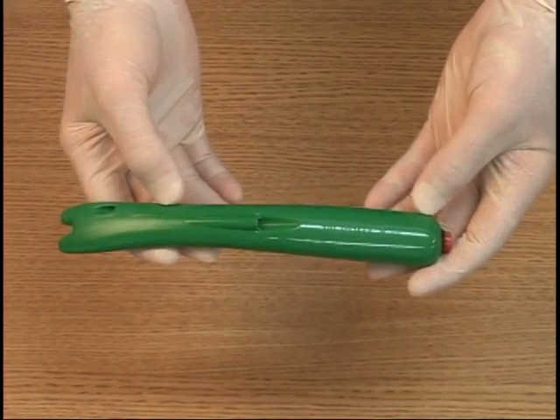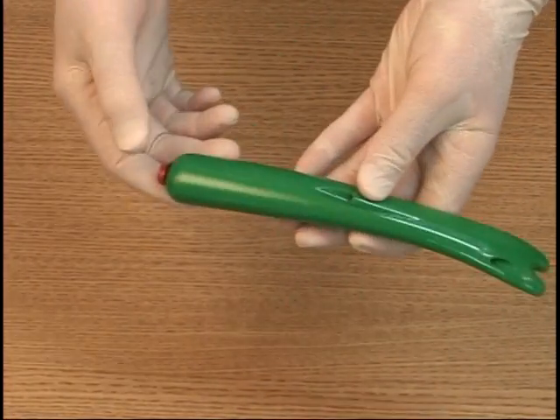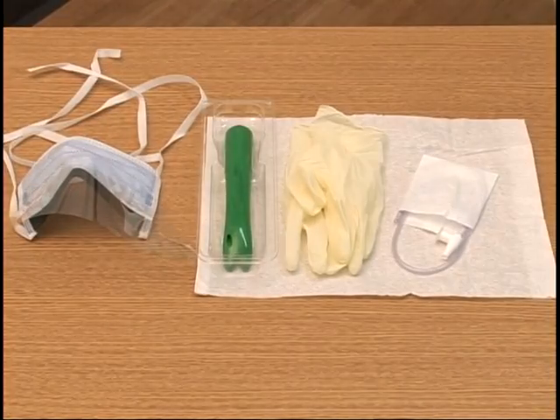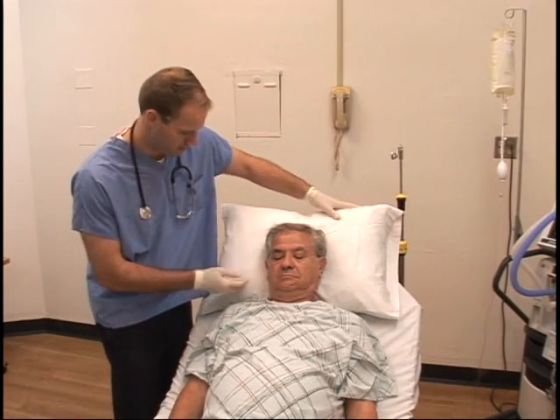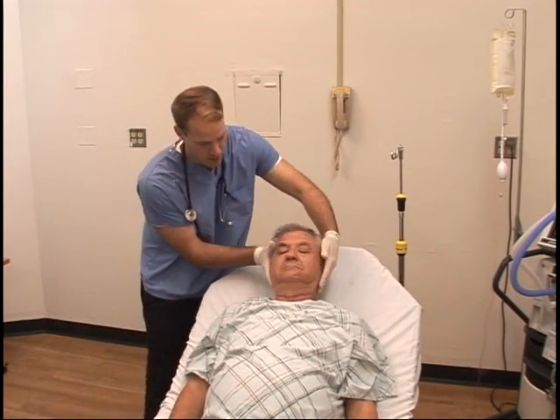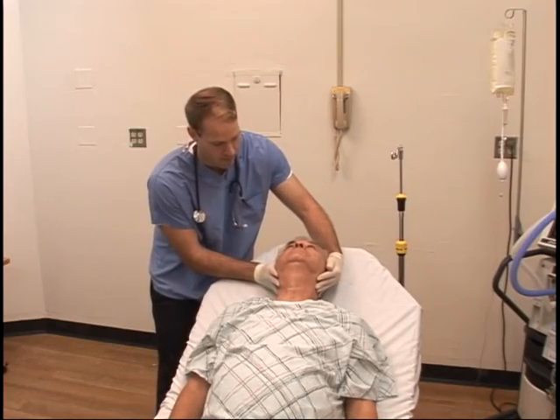With the use of the No-Bite 5, tracheal suctioning becomes quick and easy, making a patient's last days more comfortable. Have your supplies ready. If your patient's condition is deemed appropriate, remove your patient's pillow and tilt the head back to facilitate opening of the airway.